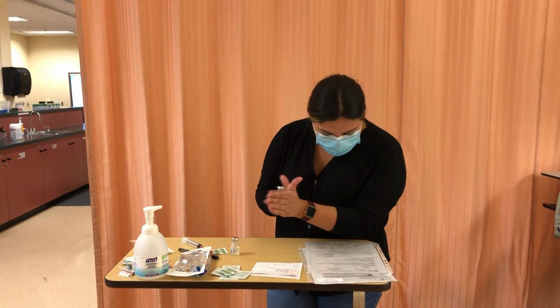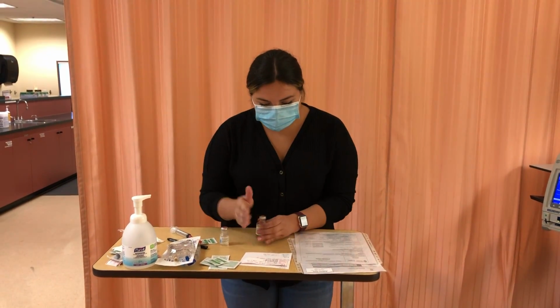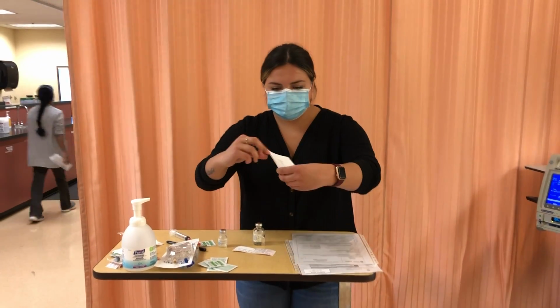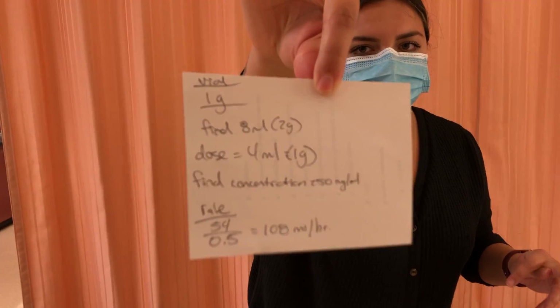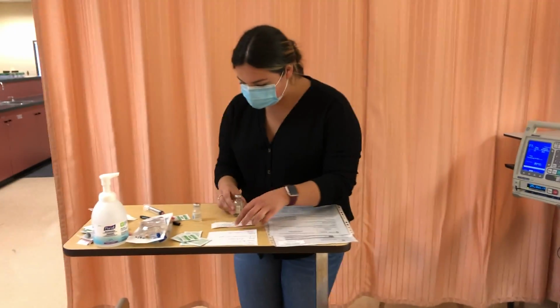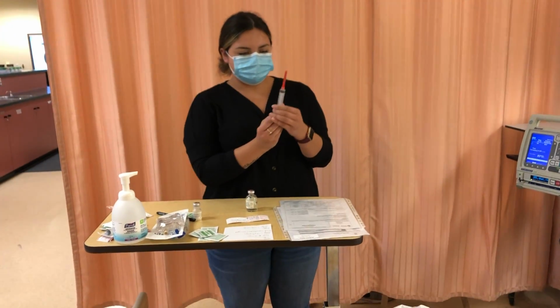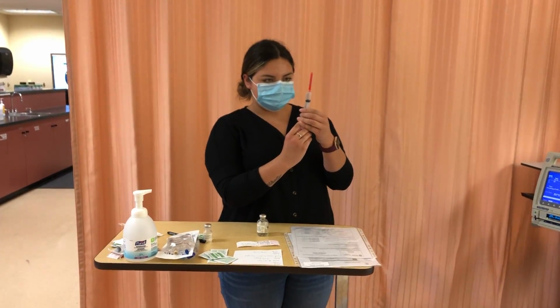So the final concentration of this vial is now 250 milligrams per milliliter. So I will need to withdraw 4 milliliters as per my calculation. Here are my calculations. So now I'm going to pull back 4 milliliters.